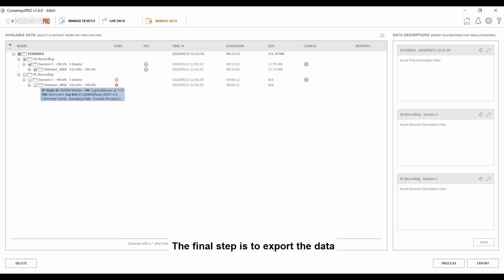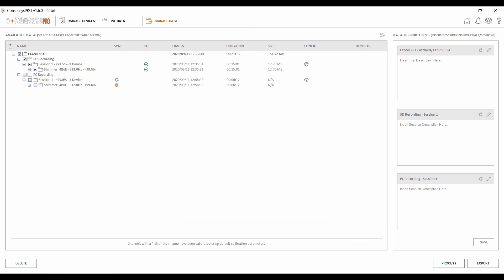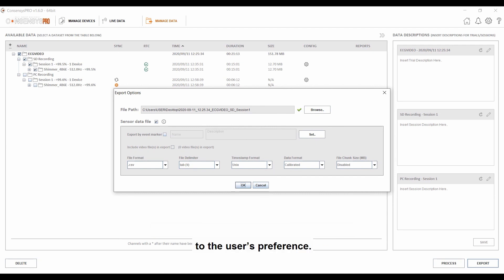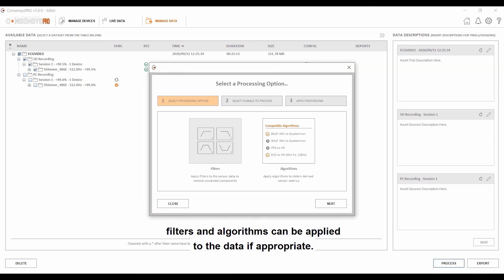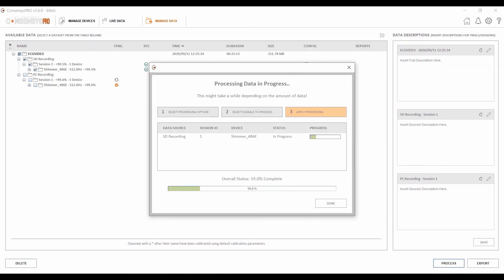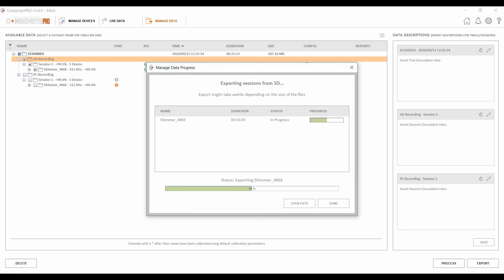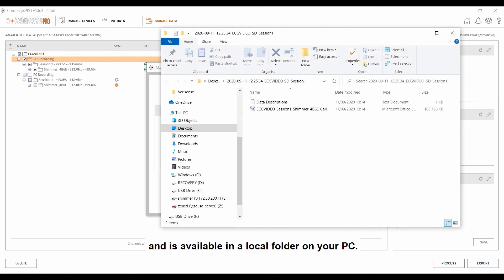The final step is to export the data if we wish to process it further in data manipulation programs such as MATLAB. We select the trial or trials that we want to export. The raw data can be exported in a number of different data and time formats to the user's preference. Also, at this point, filters and algorithms can be applied to the data if appropriate. Finally, we can see that the data has been exported and is available in a local folder on your PC.